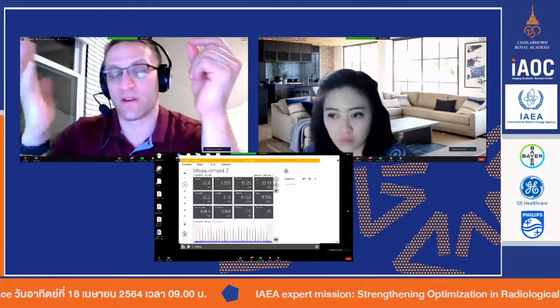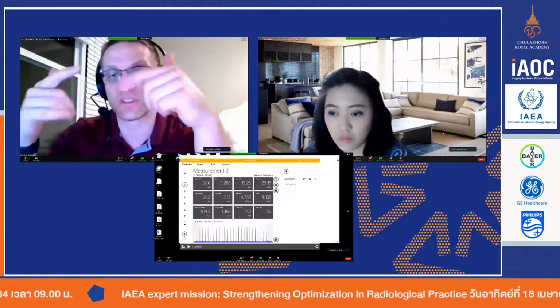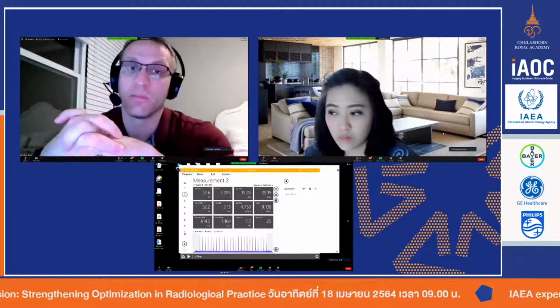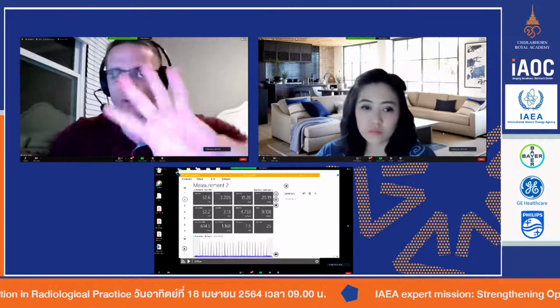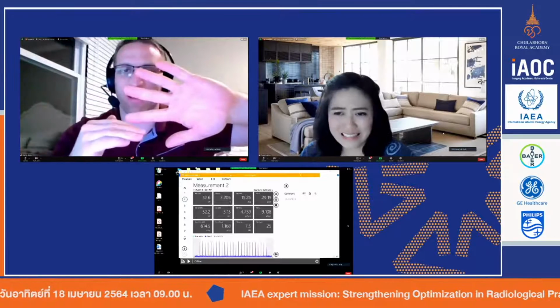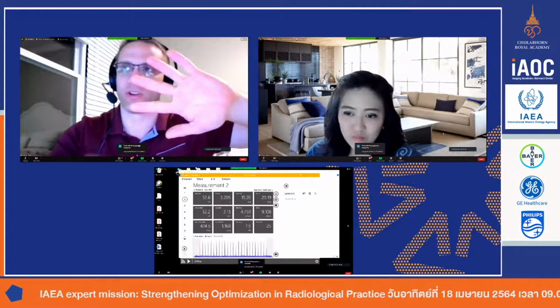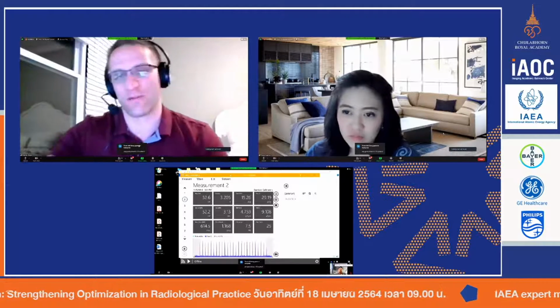You would say, hey, I want to make these adjustments. And then you would have their app specialist either come in on site or get on the phone and talk with them. And they will say, hey, change this, or they will help you change it. You can, of course, if you have the passcode, go in and make those changes. That said, you have to be careful. Remember, for example, there are 5 parameters. So if you adjust any one of those parameters, it's going to potentially adversely affect some of the others. And so if you go in and make this change here, these ones might change also. So you have to be very careful.